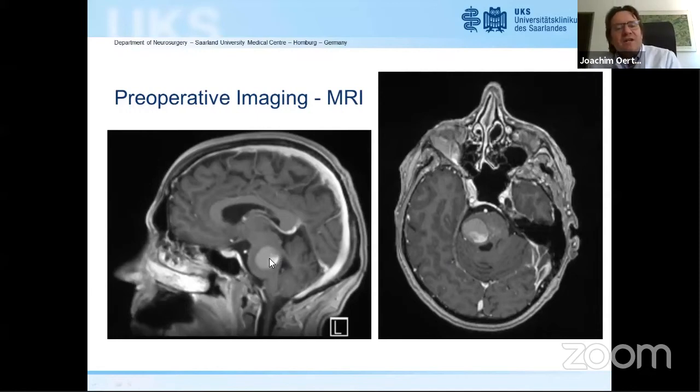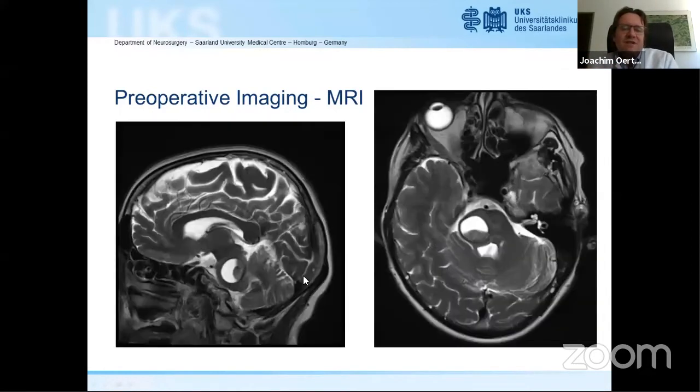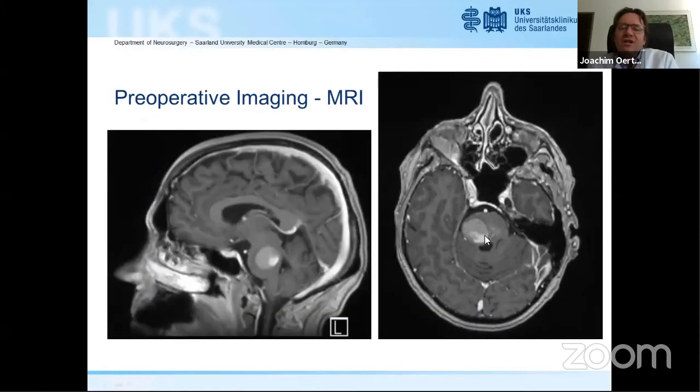You see here a solid part. So this could be the nidus. And then you have typically a hemangioblastoma cyst around it. The thing which is a little bit against this is that this cyst here is not the same color as CSF. Usually the hemangioblastoma cyst is light colored, but it would be possible. And also the contrast enhancement is not very sharp. It's a little bit unsharp. But hemangioblastoma I think is a good idea. But it was not.